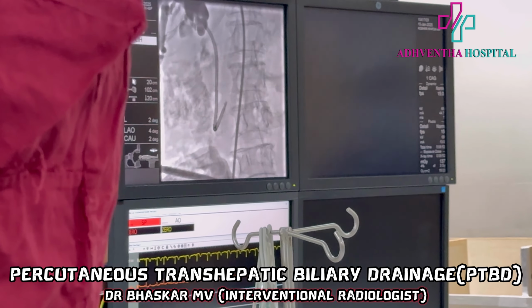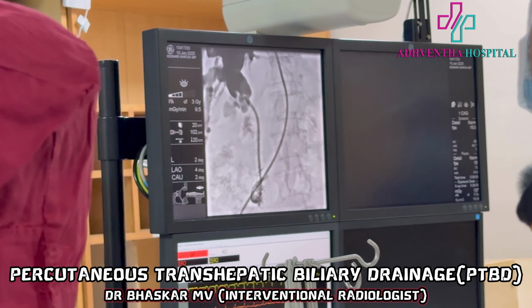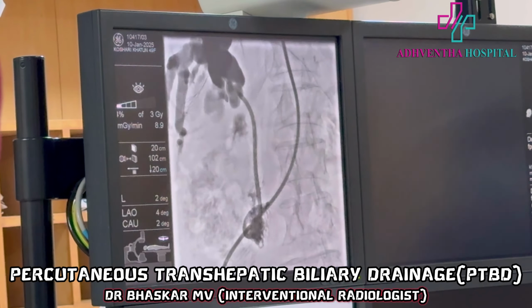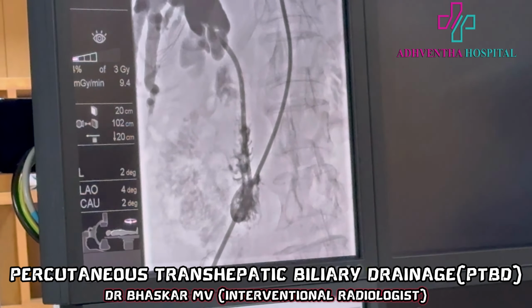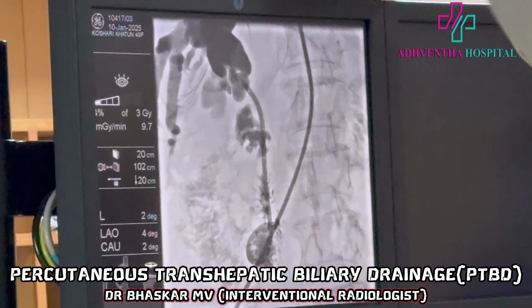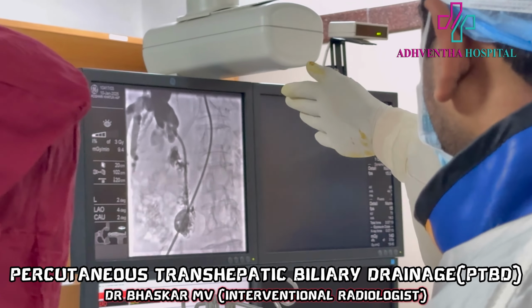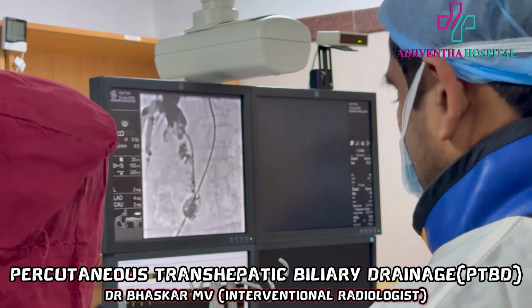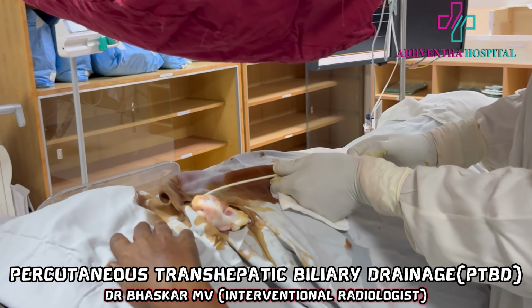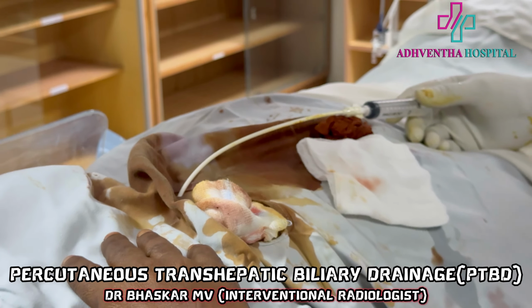Normally, in a successful procedure there should be good drainage into the duodenum. You can appreciate there is a flow of bile, whatever contrast, into the duodenum. That means the obstruction has been bypassed, and few holes are there before and few holes are there after. So this is a successful biliary drainage, PTBD, percutaneous biliary drainage.